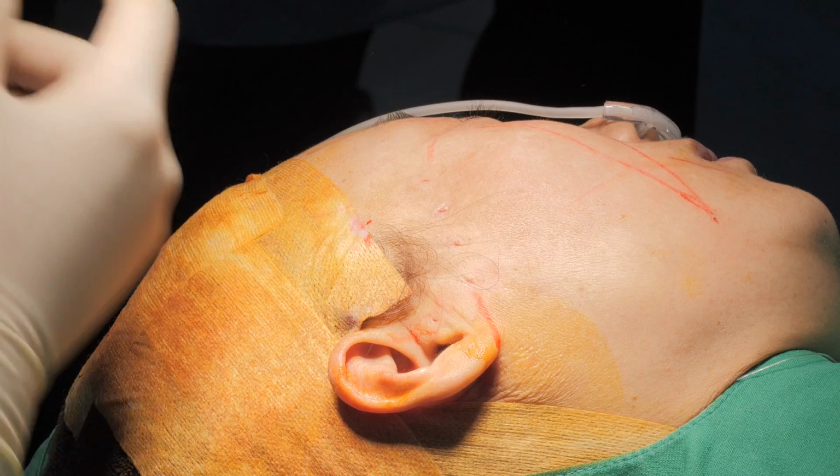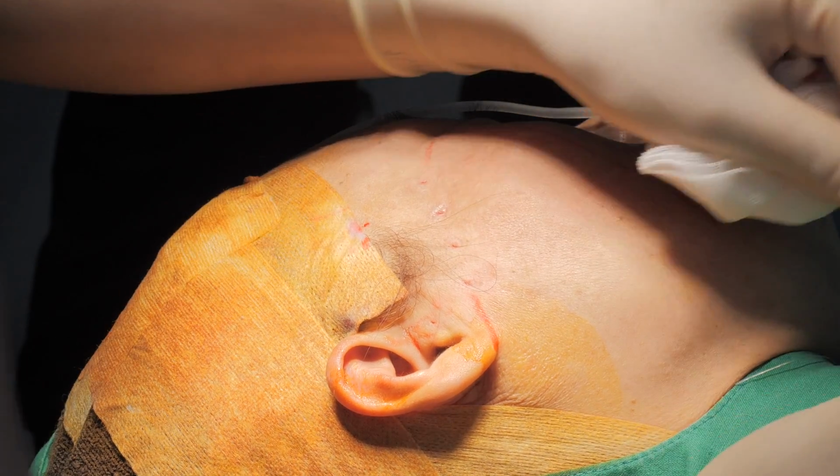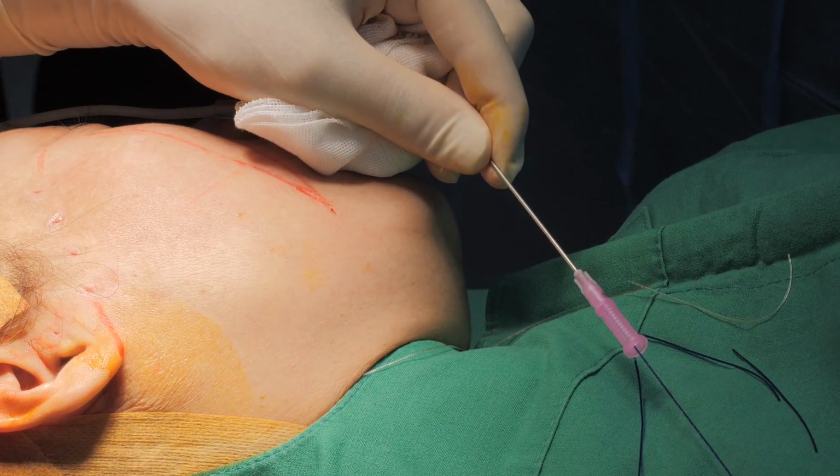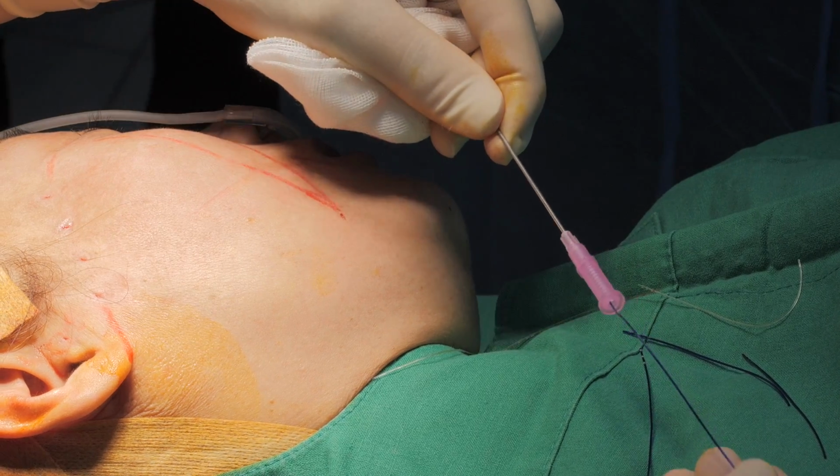Okay, the same. What's this? PDO. Master Cog. Master Cog here. Gear.